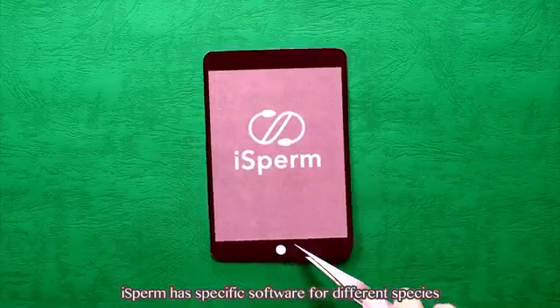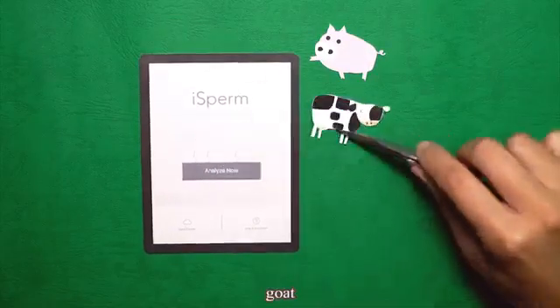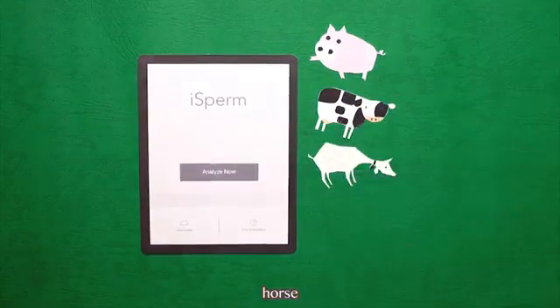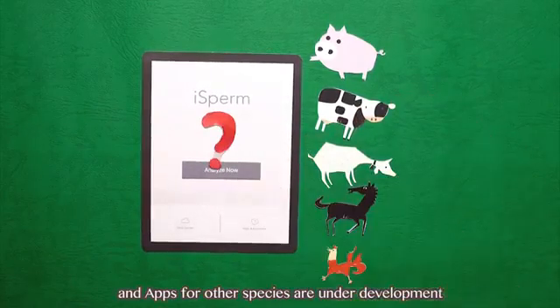iSperm has specific software for different species, such as pig, bull, goat, horse, and poultry. And apps for other species are under development.